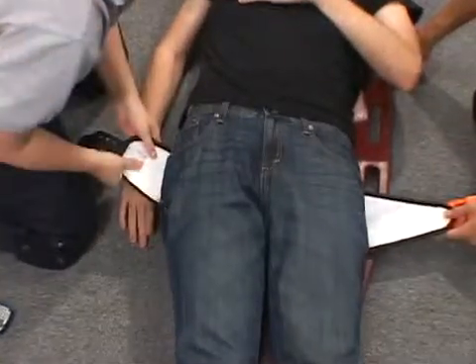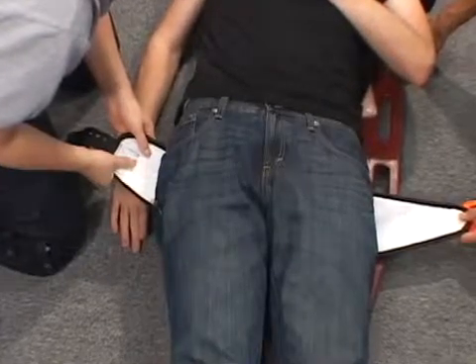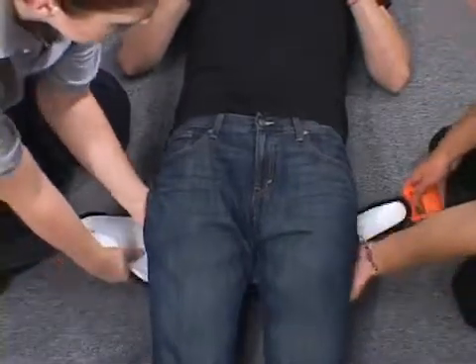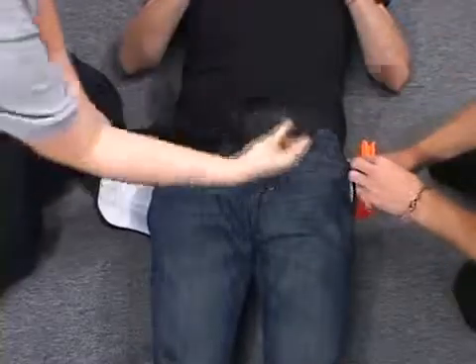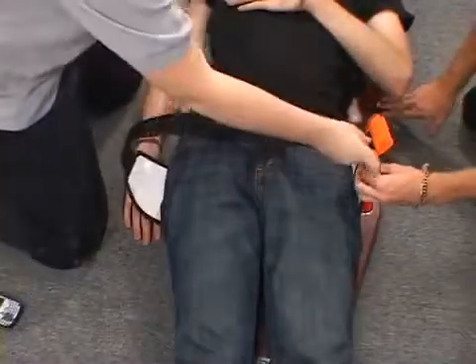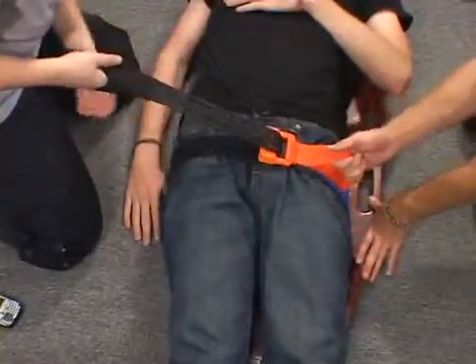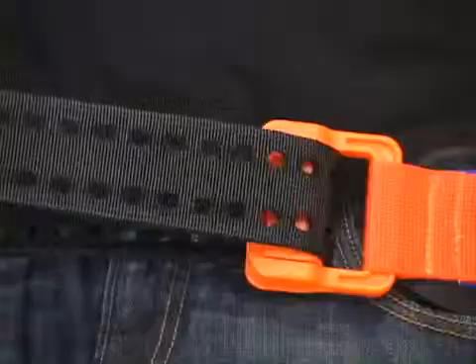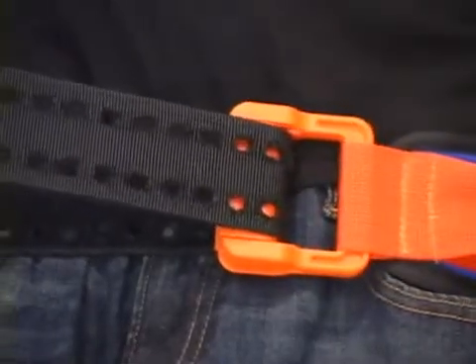At this point, the sling should be positioned beneath the patient at the level of the greater trochanters. If necessary, slightly lift the patient to position the sling at the trochanteric level and shift the buckle just off center. Next, insert the webbing through the buckle, then grasp the fixed pull handle on the other side of the belt and pull the two handles in opposite directions.